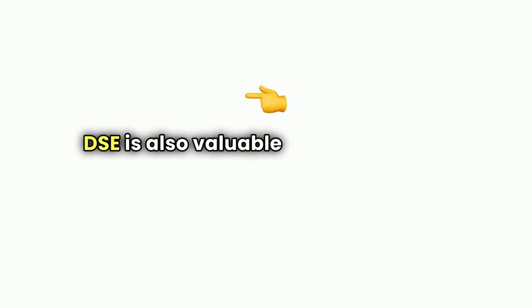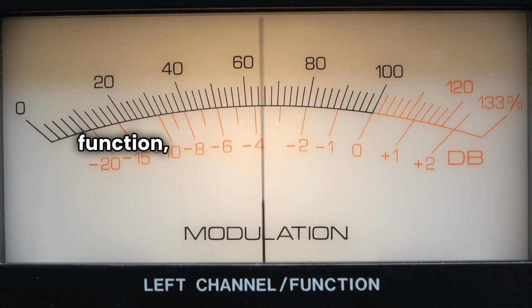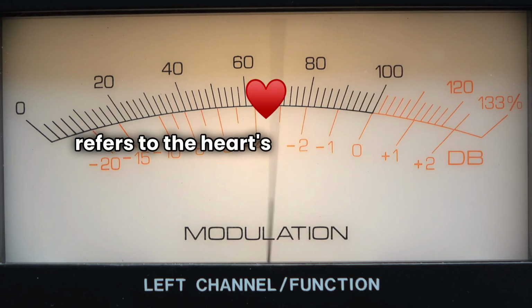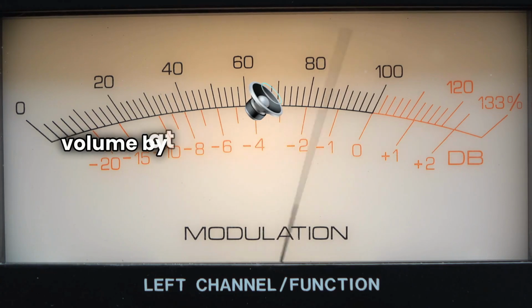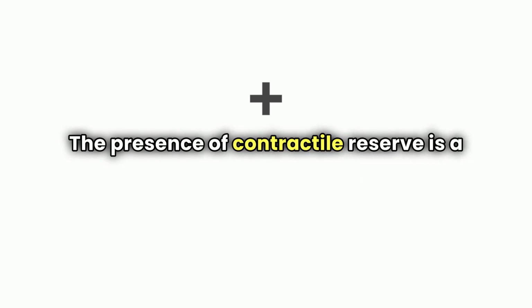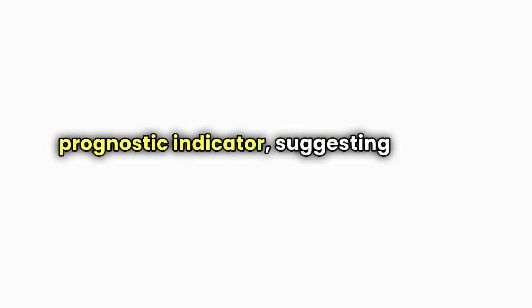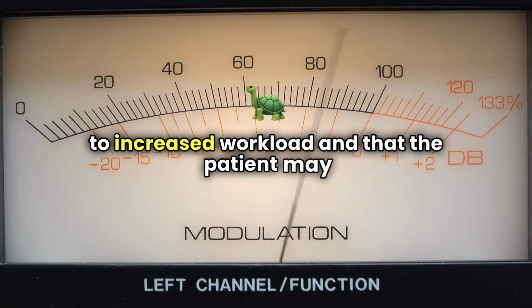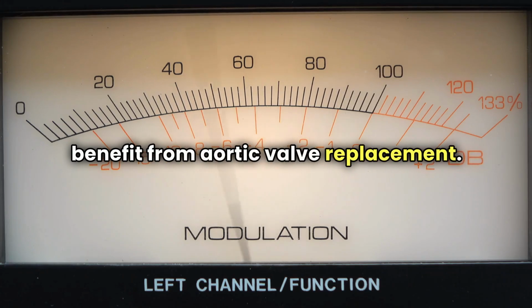DSE is also valuable in assessing left ventricular function, particularly the presence of contractile reserve, which refers to the heart's ability to increase stroke volume by at least 20% with dobutamine. In patients with aortic stenosis and reduced ejection fraction, the presence of contractile reserve is a positive prognostic indicator, suggesting that the myocardium can respond to increased workload and that the patient may benefit from aortic valve replacement.